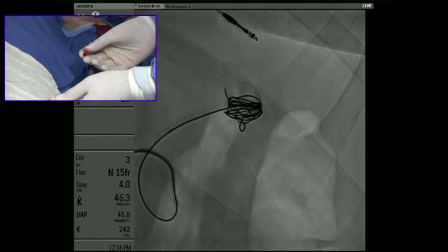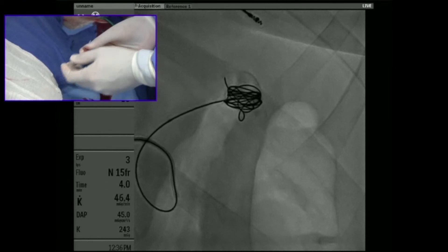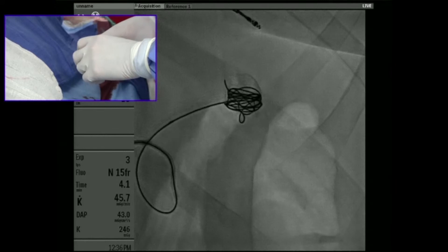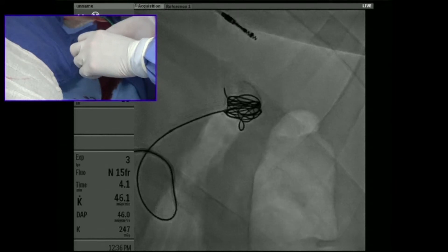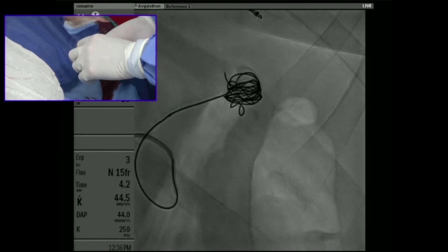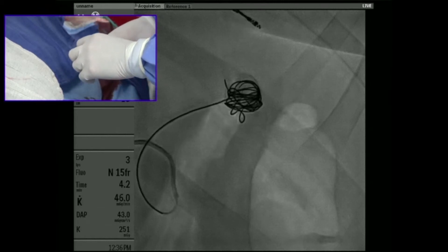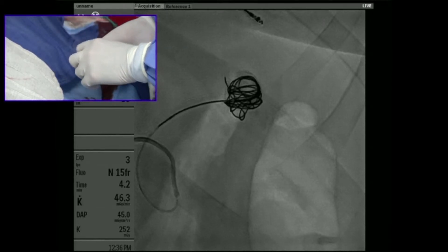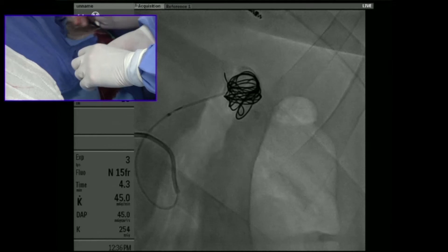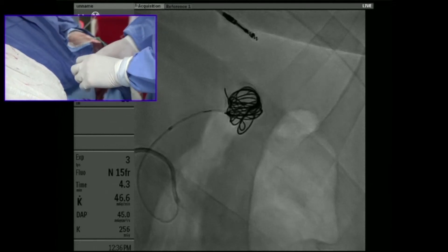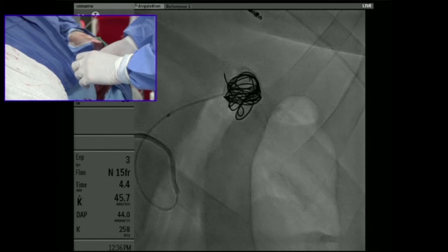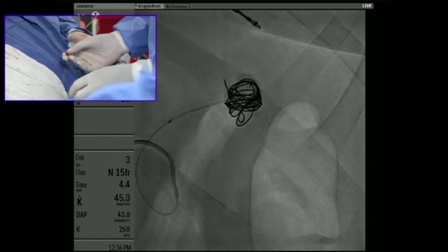I may not like the way the coil has been deployed in the aneurysm. This is very elegant technology and it dramatically improves the safety of a complex intervention like this. I can reintroduce the coil into the patient and allow it to form whatever shape I want — it's only until I'm absolutely comfortable with the configuration that I detach it.